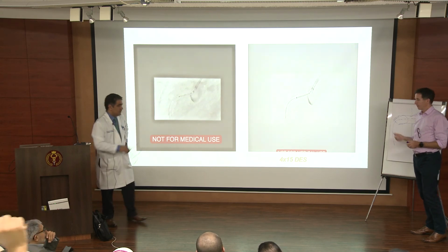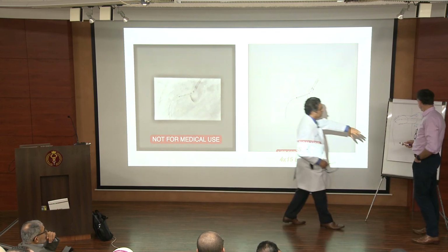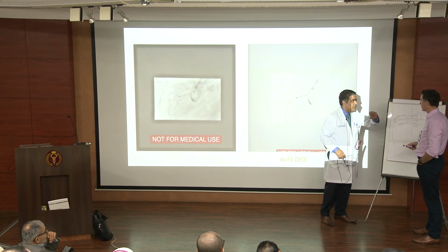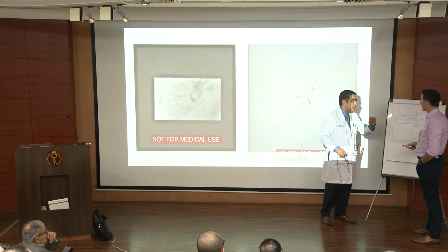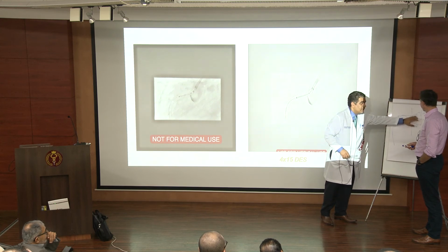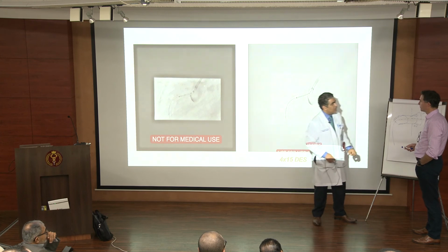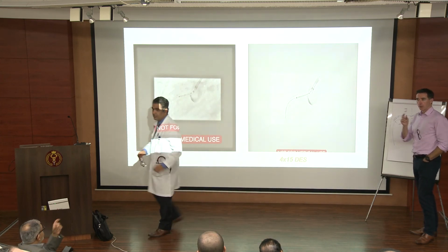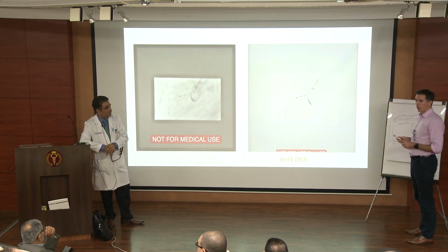Once I thought of this as well: you have the wire in the balloon like that, and then, say it's a 3 millimeter stent, so you put a 3 millimeter balloon, without the wire on the guide, and half of it is out, and I just hit it and then hit it. As long as you've got your wire down the center of it. So you understand the second way you can do it as well? Yeah, but we did it with these cases.